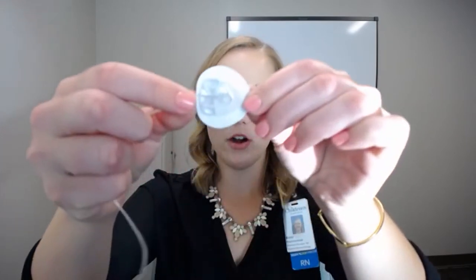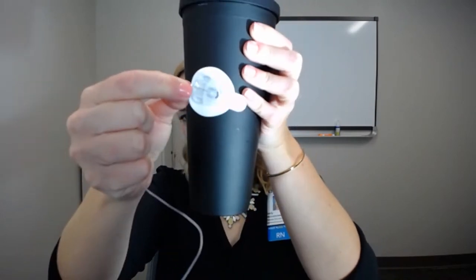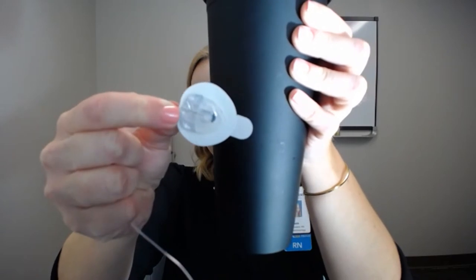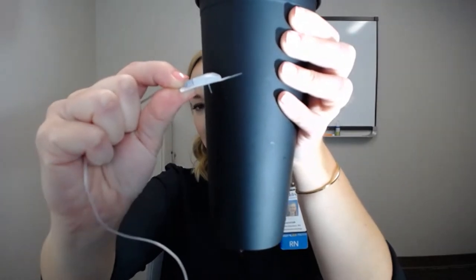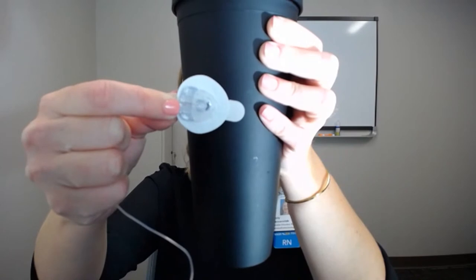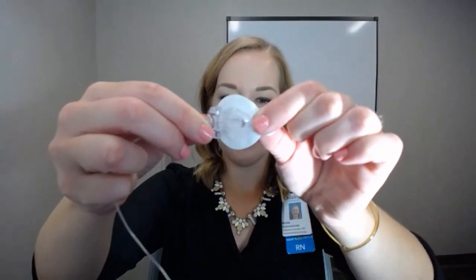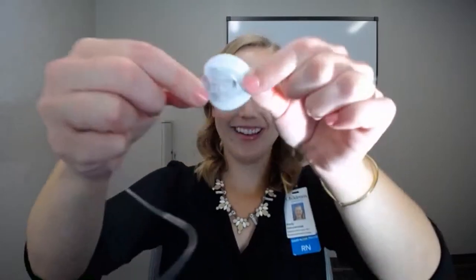So an infusion set looks something like this — and again there are multiple types. I'll use my water bottle to give you a better image. That's the infusion set sitting on your skin, and if I turn it sideways you can see that little plastic cannula coming out 90 degrees from the adhesive. You can clip in and out, which is really nice — the adhesive holds the cannula under the skin, and you can release the tubing to disconnect for showering, bathing, anything like that, then just clip back in.